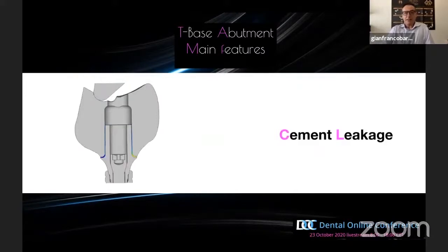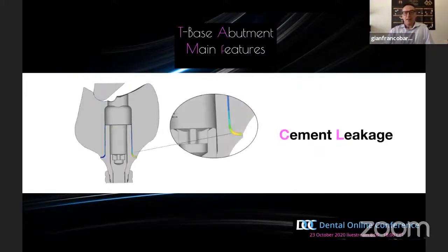Another thing is the cement leaking round: the non-sharp shape makes possible a distribution and a leakage of cement during the cementation of the restoration.